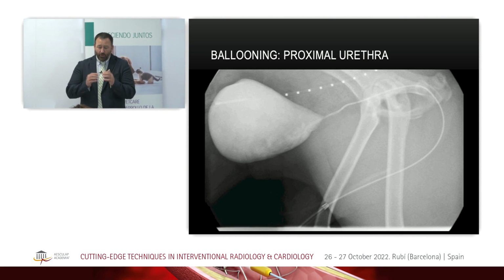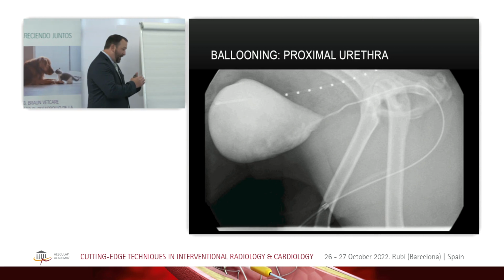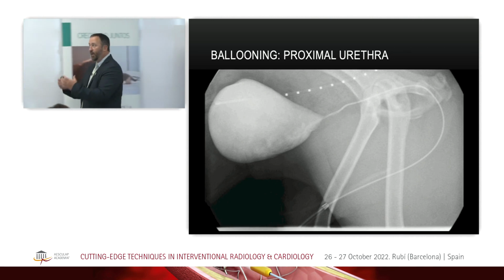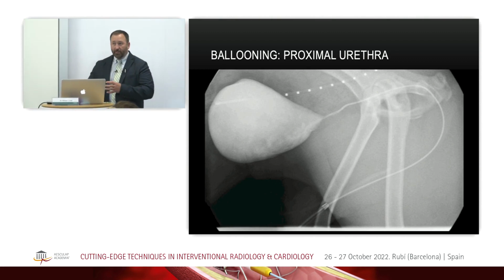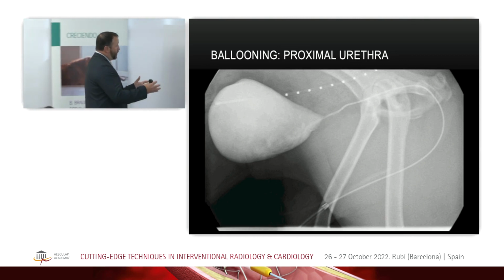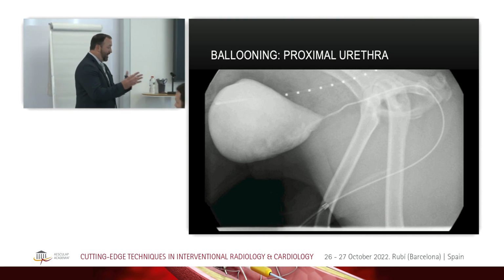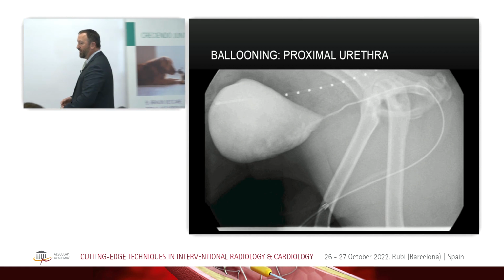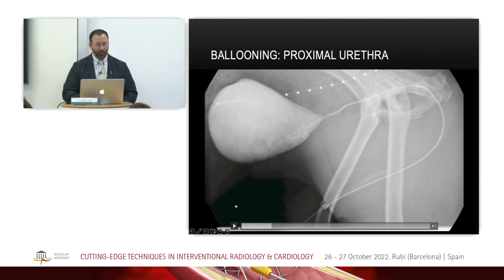Yes, we can see luminal compression or luminal changes just from having an incision on one side. You could see it close down, but technically a stricture is that kind of 360 closing down. And so this would be that classic case. For anyone in here that hasn't seen a prostatectomy before, you basically have a complete removal of the urethra in that region. And so you have urethra end, and then you put them back together. So that's what we're dealing with here. This dog had a prostatectomy and now can't urinate after having the urethral anastomosis performed.